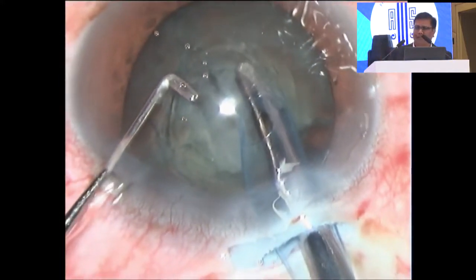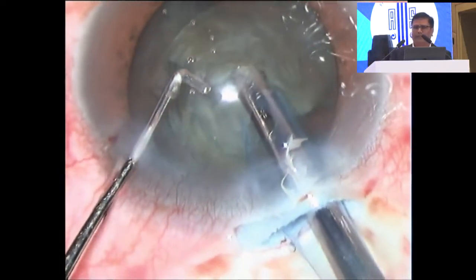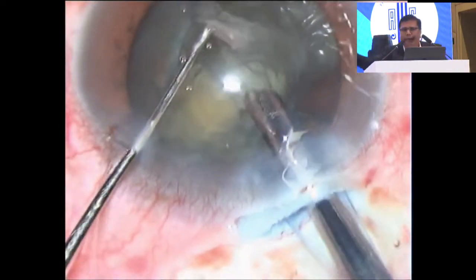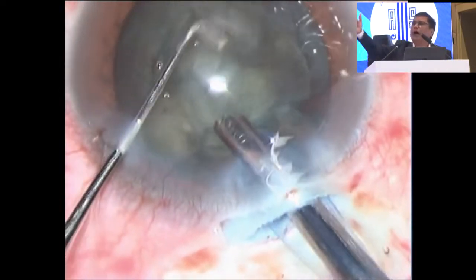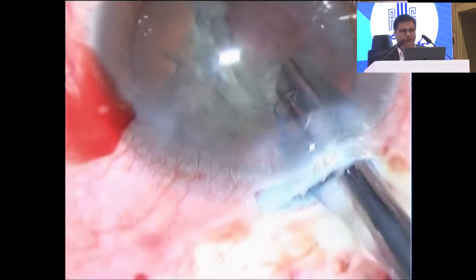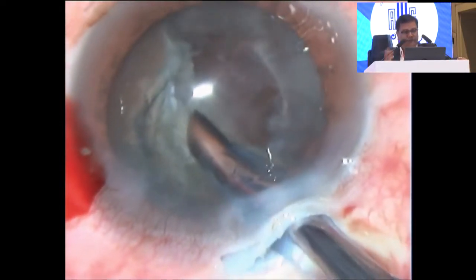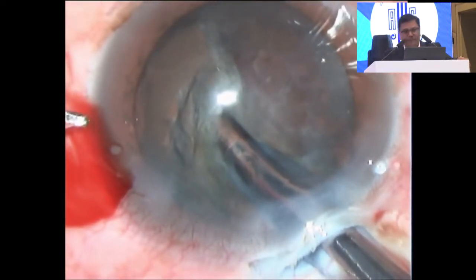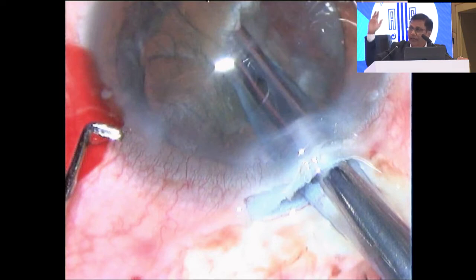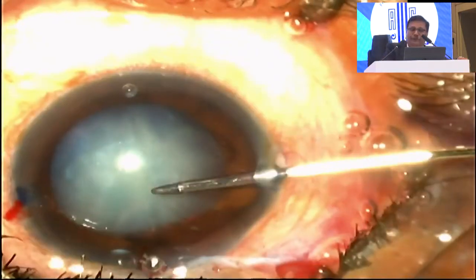Very slow uplifting. As we have seen in Ragini madam's presentation, all the nucleus management is in a supracapsular plane. That is very important because the bag is weak. So you have to lift the nucleus out of the bag to preserve the bag, not to give pressure on the zonules. That's the main principle here. Then go for the other nuclear half piece and lift it out. These slow movements are very important. Otherwise also, hold and lift of the nucleus should be very slow in routine practice also. In this specific case, there should not be any stretch on the bag or zonules. That is the thing we have to keep in mind.